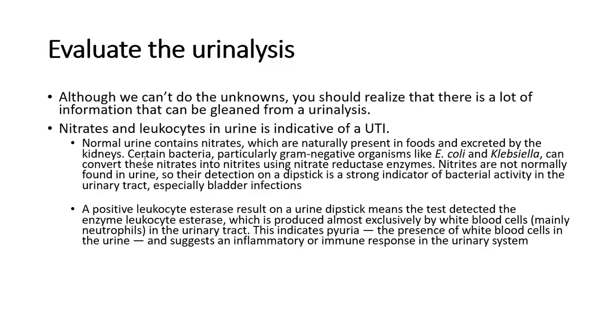A positive leukocyte esterase, as we said, detects an enzyme that is almost exclusively produced by white blood cells, mainly neutrophils, which are your bacterial eaters. And this indicates the presence of white blood cells in the urine, okay? So then we would go and do a microscopic analysis.